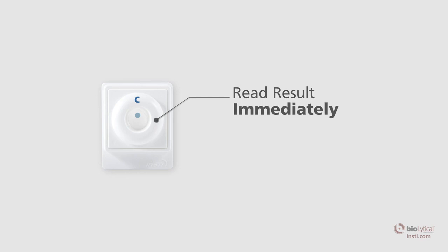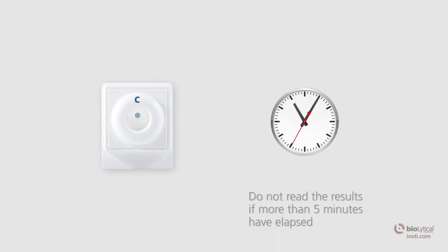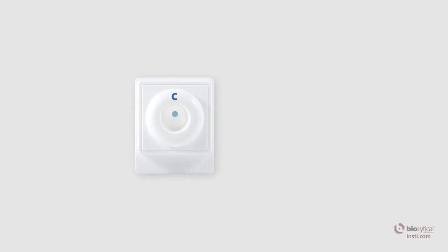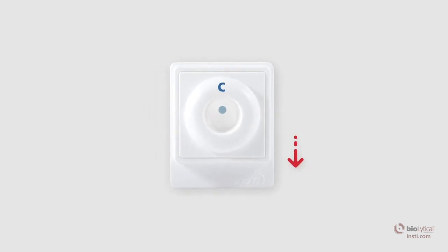Immediately read the result while the membrane is still wet. Do not read the results if more than five minutes have elapsed following the addition of clarifying solution. When reading the results, make sure the tab of the membrane unit is oriented towards you.